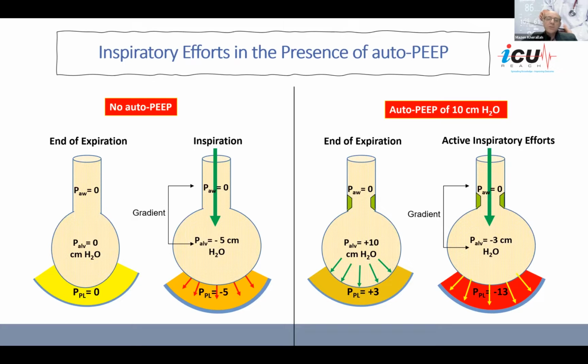So you can respond to the flow in a faster way than to the pressure. So that's number one, to just explain the pressure versus flow. If you have a ventilator that has both options, I would recommend to use the flow option. Always set it to be triggered by the flow.